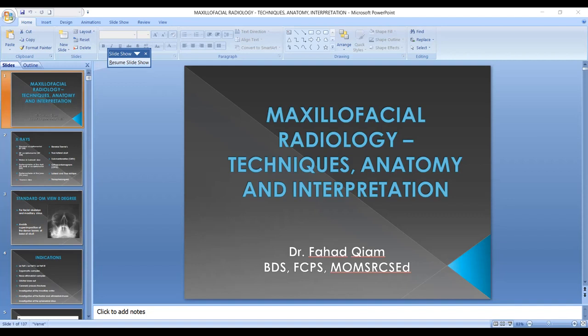The dense bones present in the base of the skull, the mastoid and the occipital bones, are a lot denser compared to your anteriorly placed bones, which are a lot thinner and less dense. So when you tilt your head upwards, you can sense that your mastoid and your base of skull go downwards, and the anterior part of your face goes upwards.